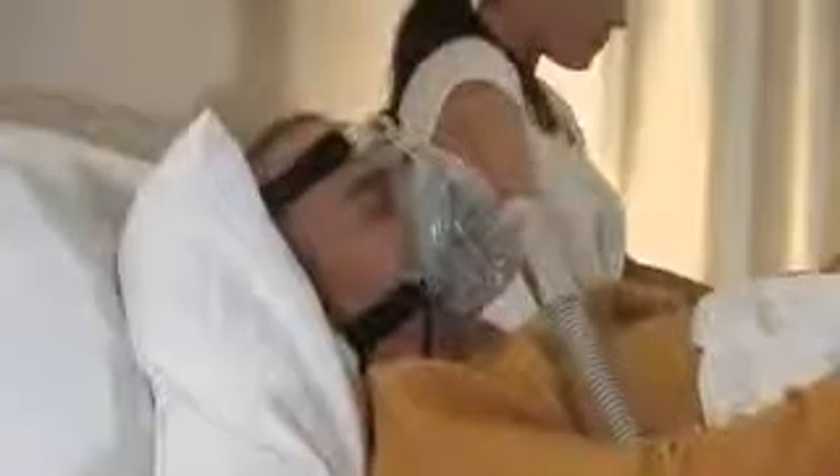Once in the sleeping position with your mask connected, you may need to make some fine adjustments. It is also recommended that you pull the mask base slightly away from the face. This allows the silicone to inflate. Then place the mask back onto your face.